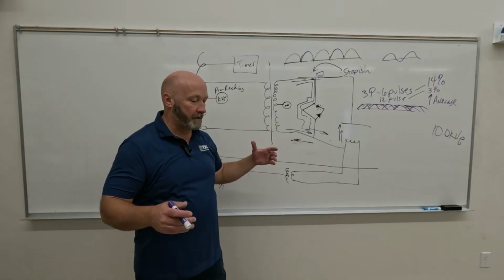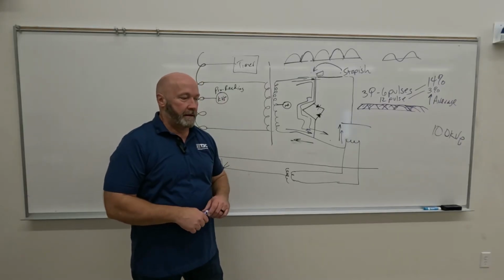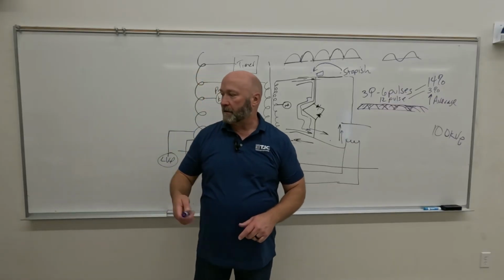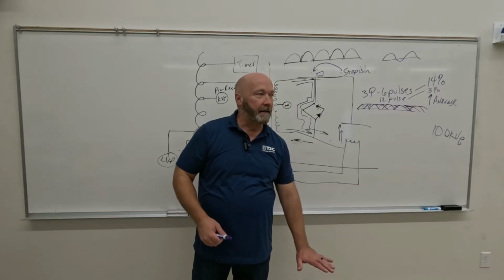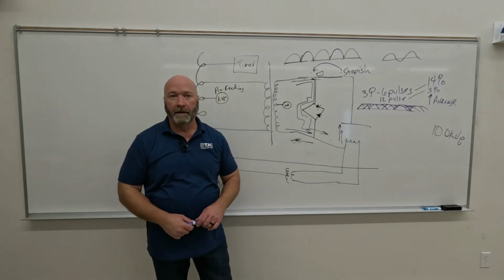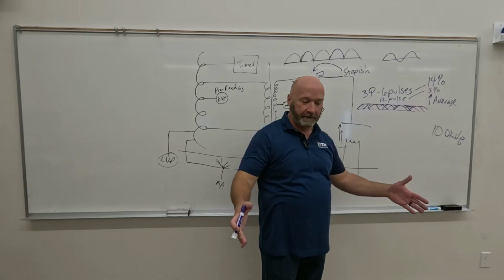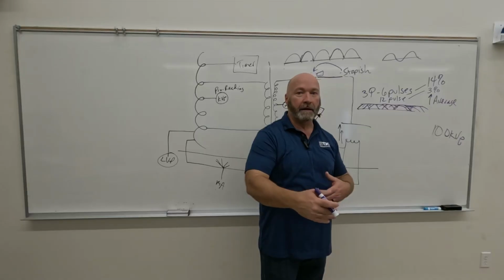Okay, so our lab over in Pirtle, before we built this building, was a single phase machine, and the generator, the high voltage transformer, was in a box almost as big as that podium. I mean, this thing was 2.5, 3 feet high, and it was a cube, so it was pretty much 3 feet in every direction, right? And they're getting ready to put this one in, and if you look at the back of the room on the right-hand side, there's a box that's maybe 3 feet long and 3 feet tall, but it's only about a foot wide.